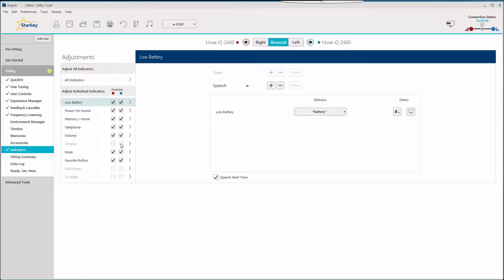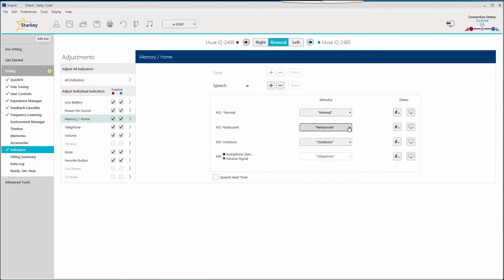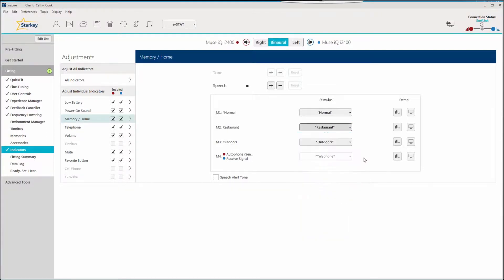One of our most exciting enhancements in our new Muse IQ and Halo IQ hearing devices is memory-specific speech indicators. Click on memory. Each memory displays with a drop-down menu next to it. Click on the drop-down to access the personalized memory options.